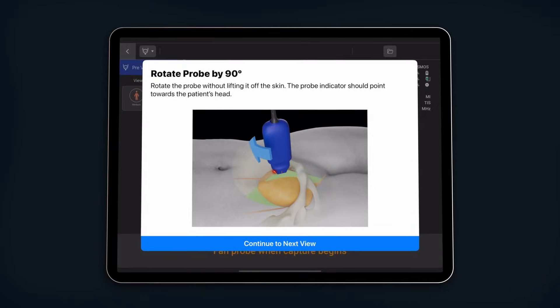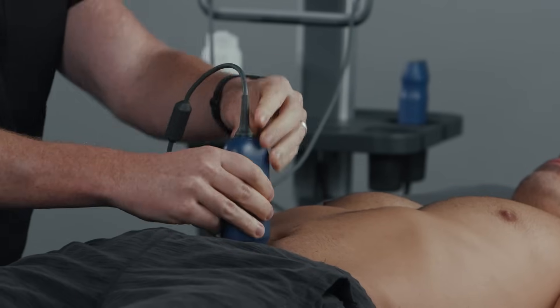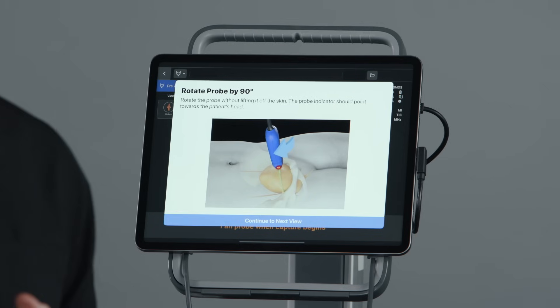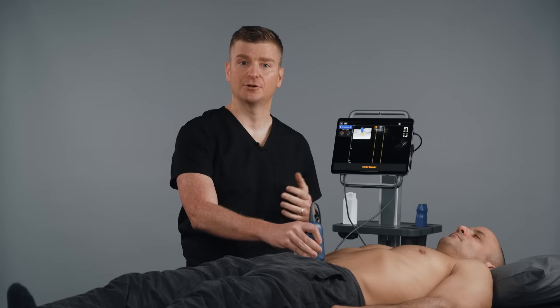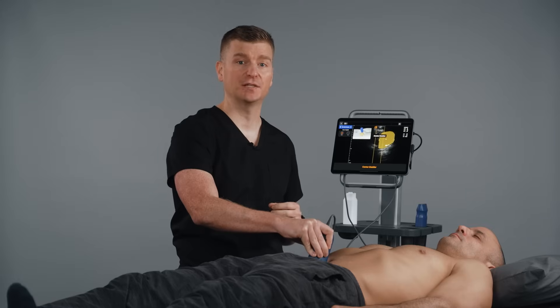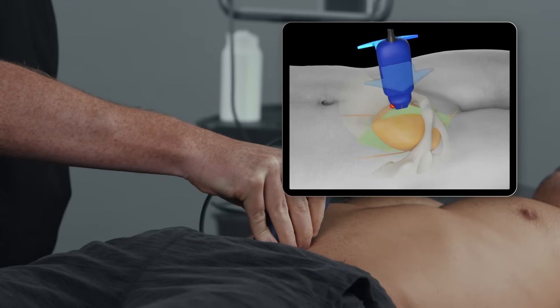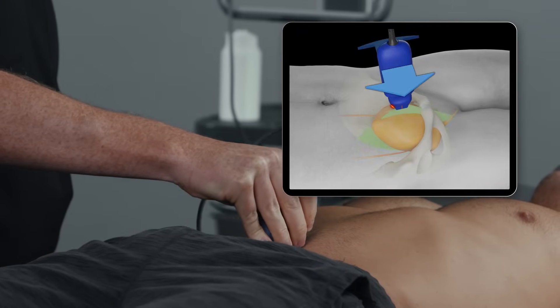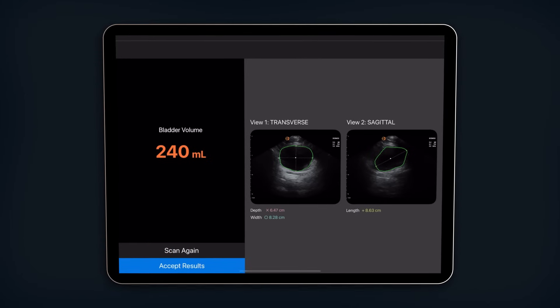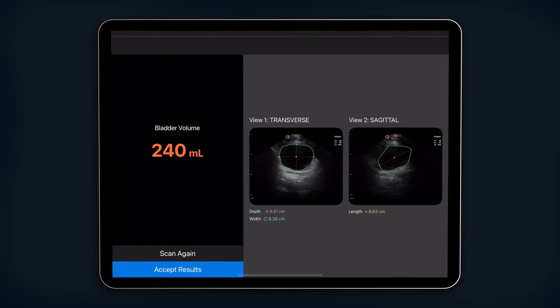With the transverse view complete, you will be prompted to rotate the probe 90 degrees so that the probe orientation marker is now facing the patient's head, and we can obtain the sagittal view. Hit continue to next view. Again center the bladder on the screen so that it appears green, then start your fan, this time tilting the probe from hip to hip for the sagittal view. Once the AI captures the sagittal view, you will be directed to the results screen where you will see your bladder volume measurement. You can choose to accept the results or scan again if you're not happy with your scan.